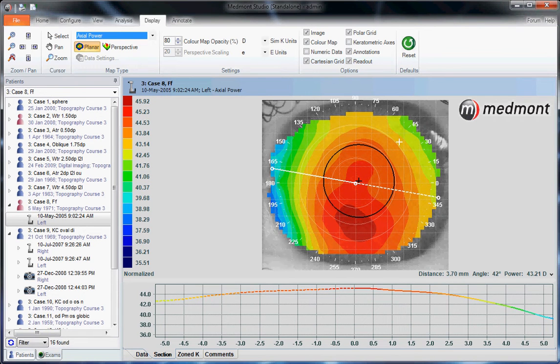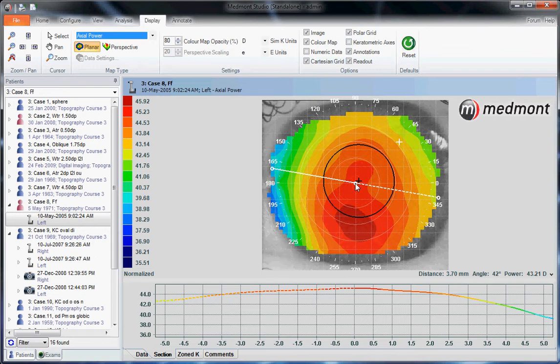This video reviews the disease detection indices in your MedMon E300 corneal topographer. We've clicked on a topography that has the appearance of a possible diseased eye, but how do we determine whether this is actually normal or abnormal?